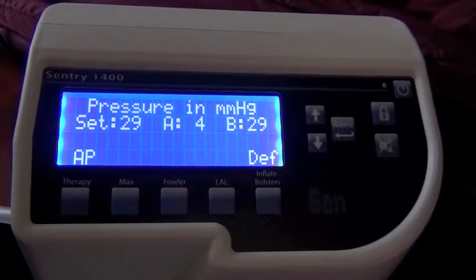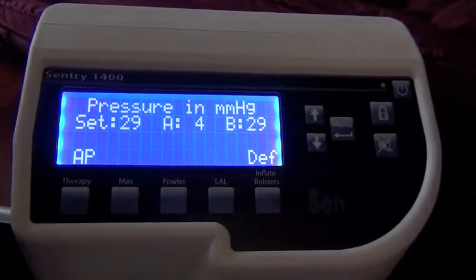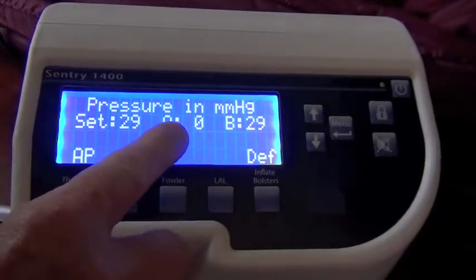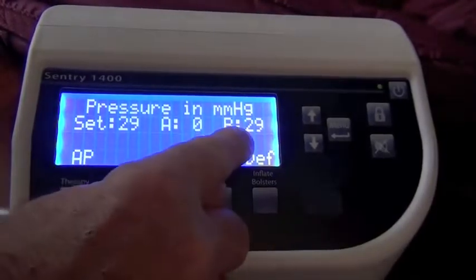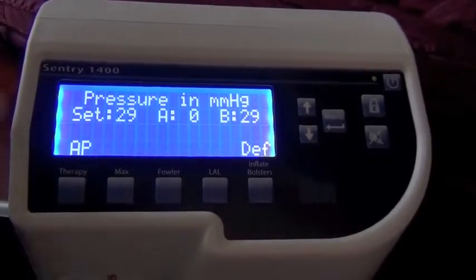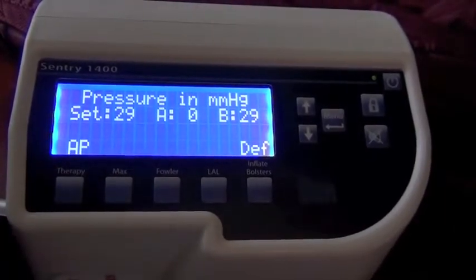But only high enough again to address that initial weight that we put into the system. So what you're seeing now is we have 10 of the 20 pillows assigned to A and 10 assigned to B, and the B cells or B pillows are fully inflated to our set pressure of 29, and the A cells show a pressure of 0.